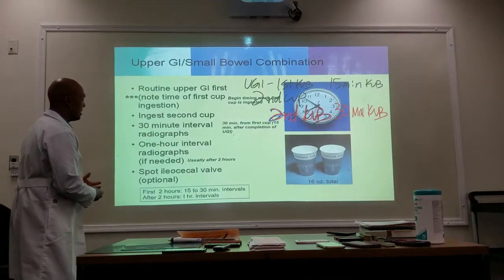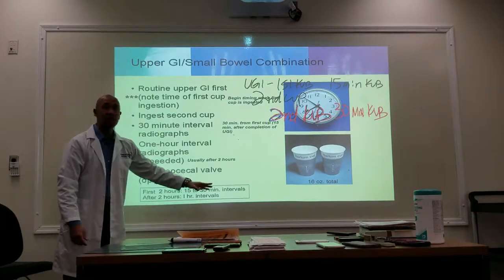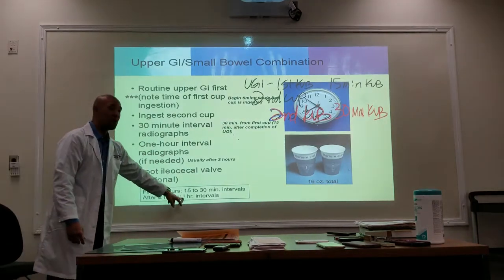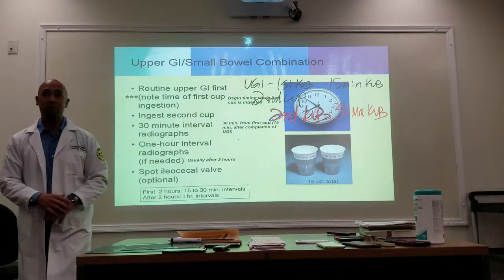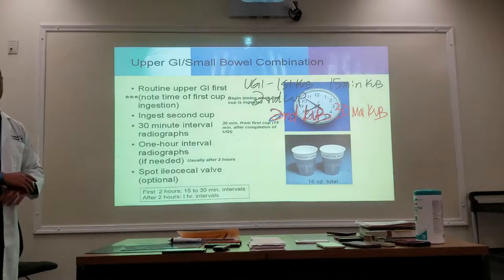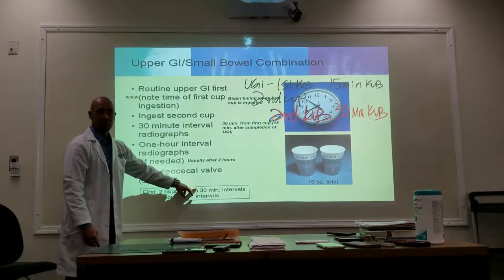Now, generally, this is the practice. For the first 2 hours, we take them in 15 to 30-minute intervals. After a couple hours, we start shooting them at 1 hour intervals. If it starts taking this long, there's generally some kind of problem with their small bowel. Regularly, it doesn't go past 2 hours, but sometimes it does. So for the first 2 hours, you do your regular intervals.